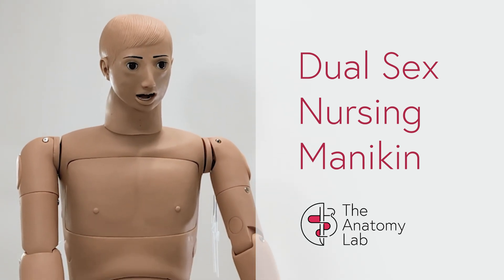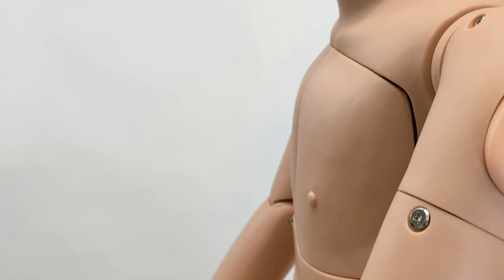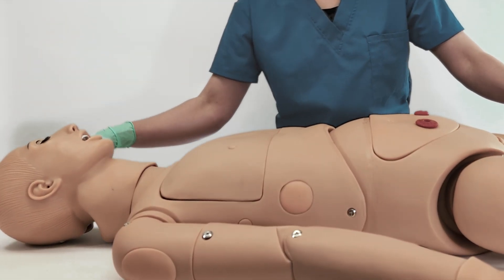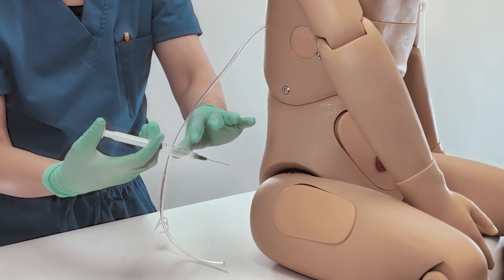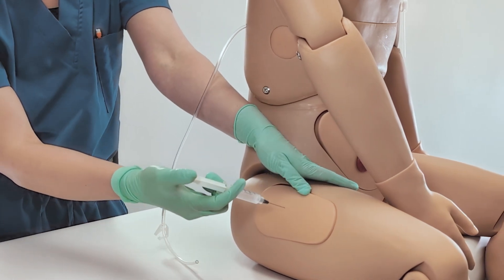This is the Anatomy Lab Dual Sex Nursing Mannequin, a versatile and cost-effective patient simulator designed to provide a clinically relevant training environment to medical trainees. With a multitude of tools and accessories included, this model facilitates the practice of a range of essential nursing skills.